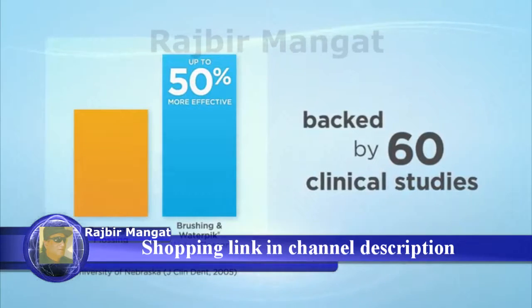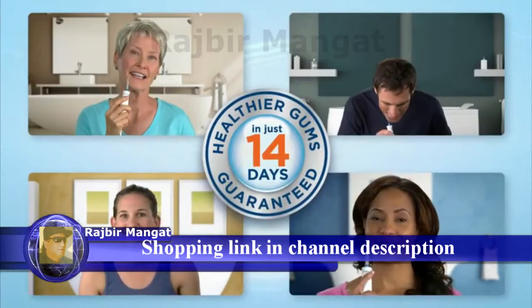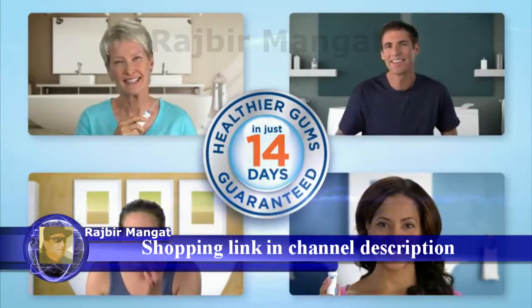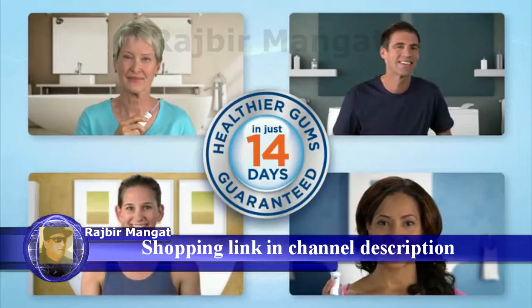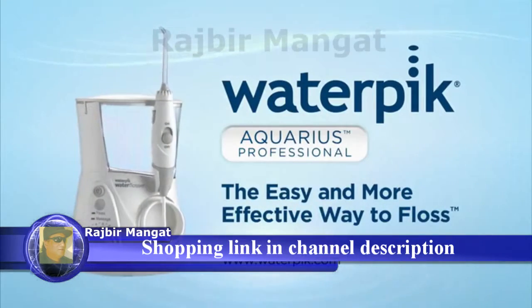And best of all, the Aquarius is backed by 60 clinical research studies and is guaranteed to give you healthier gums in just 14 days or your money back. The new Waterpik Aquarius, the easy and more effective way to floss.